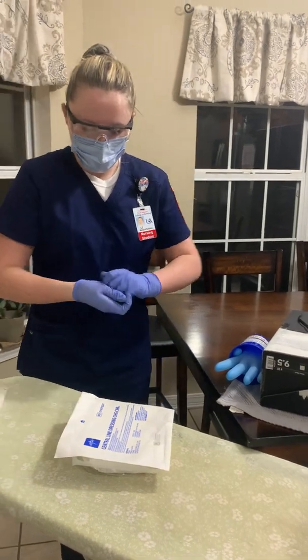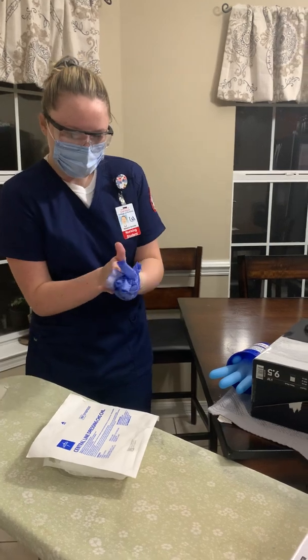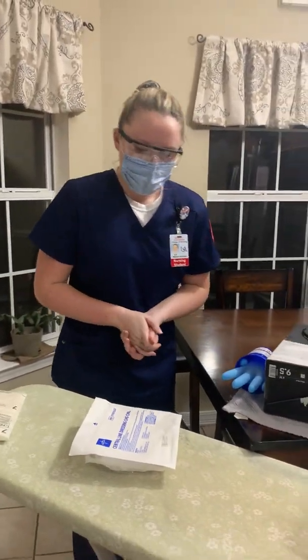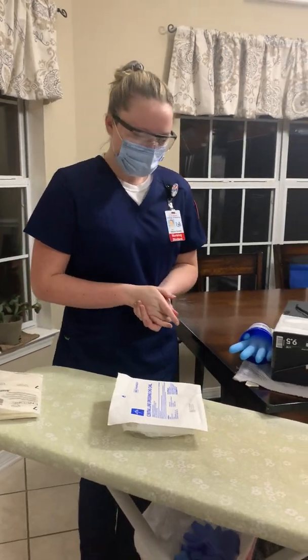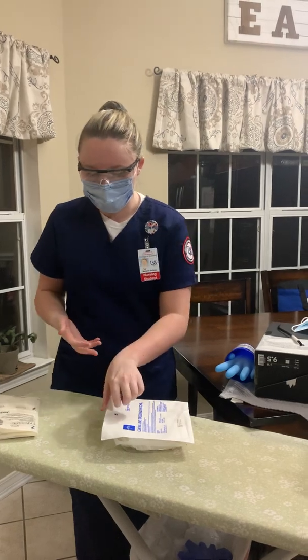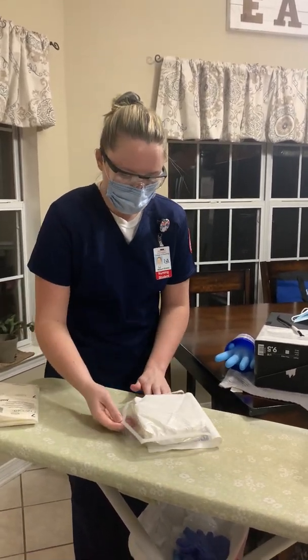Okay, so now I'm going to take my gloves off, glove to glove, and skin to skin, and throw those in the trash, and then perform hand hygiene. Okay, so after that, now I'm going to move on to opening my sterile field. So I'm going to open my package and set it down.